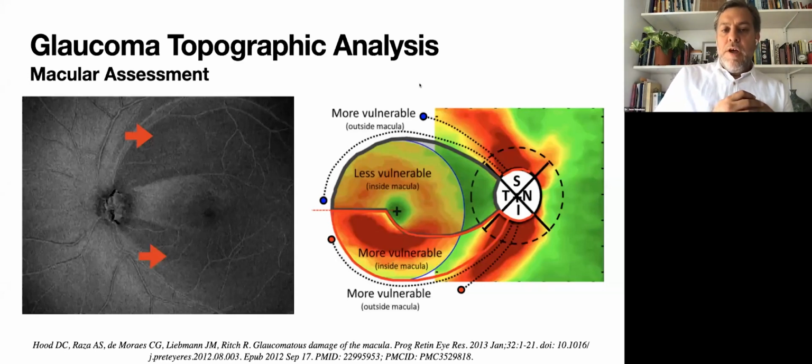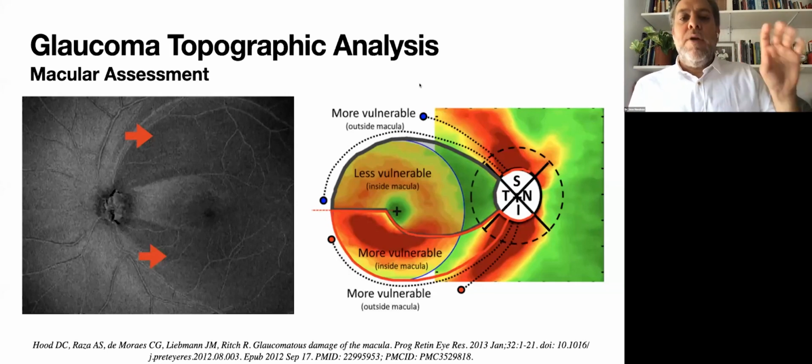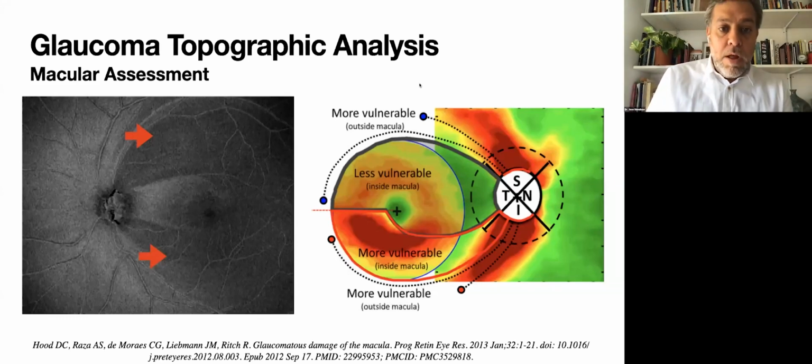The HOOD report helps us a lot to have a lot of different information in just one single view report. When you are really used to looking at it, it will help a lot. But I do always look at the metrics, the other reports, the optic nerve test, and the visual field test.